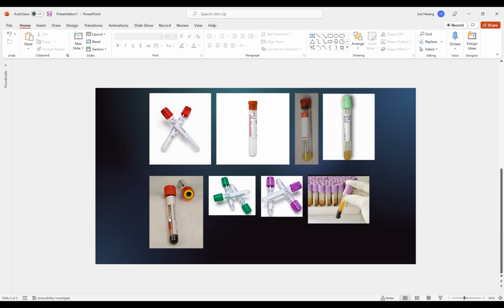So we had some confusion there, some people thinking the serum was on top and the plasma was on the bottom, or vice versa. Serum and plasma are both the liquid part on top. It's just a matter of whether it's clotted or not clotted. All right, any questions there? We can keep going over this. It just takes more repetitions, but just keep that in mind.